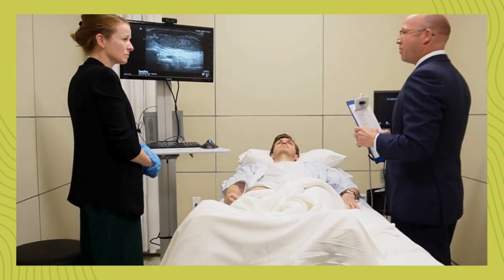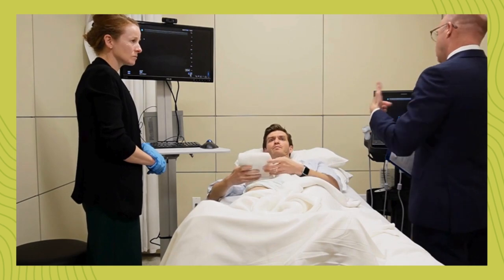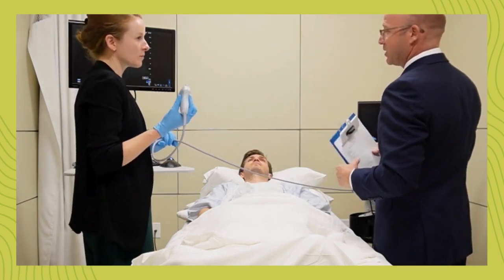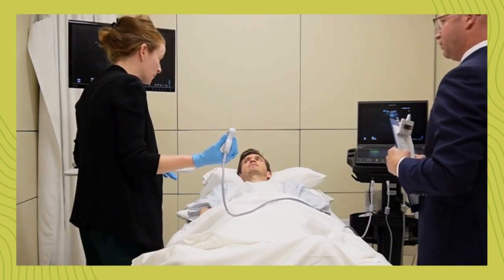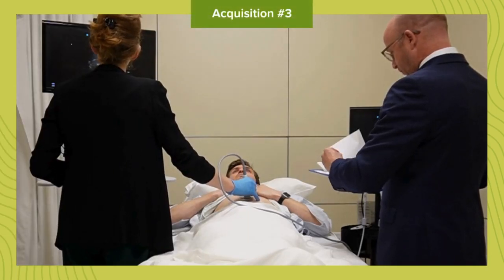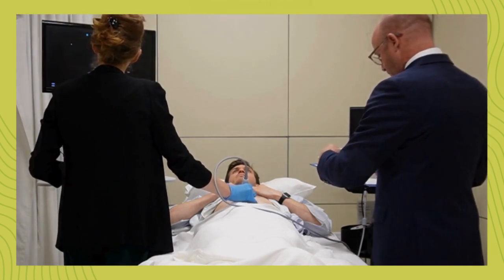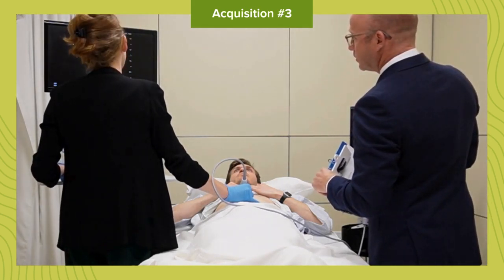Now, as you've been here, your patient has become a little more hypotensive and tachycardic. I would like you to use ultrasound to assess the patient's IVC for his fluid status. Which probe would you like to use? Can I use the curvilinear probe, please? Please demonstrate and describe to me how you would use the ultrasound to visualize the patient's IVC and what you would be looking for. Would you mind exposing your belly for me? It shouldn't hurt, but let me know if it does. I'm using the curvilinear probe in the epigastrum, and I'm looking to identify the IVC. I think this would be my image.